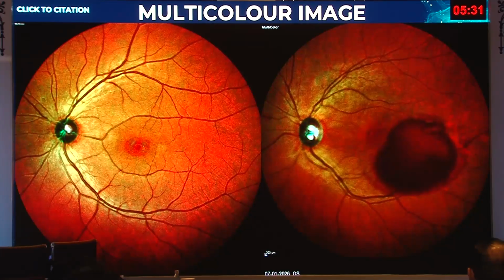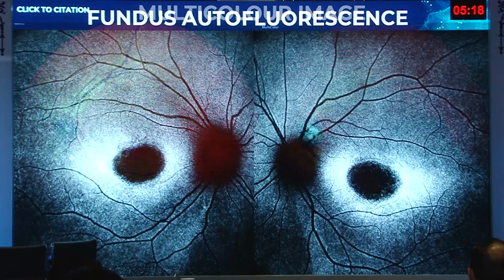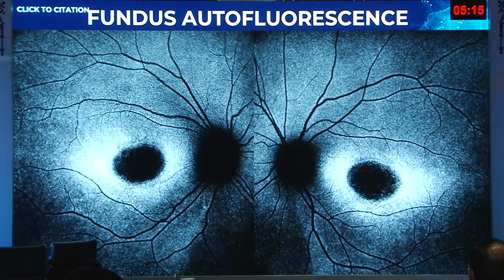Then you have the option in Heidelberg also, the option of this multicolor imaging, which is seen. The contrast per se is not so great, but multicolor is of use, especially when you don't have proper color fundus photography. Next, let's go to fundus autofluorescence.